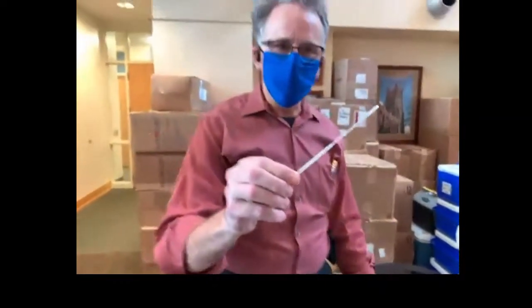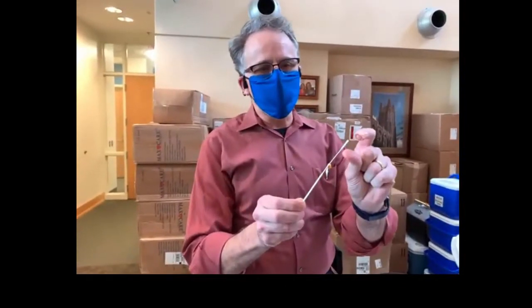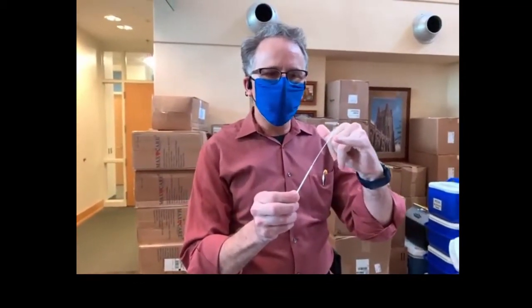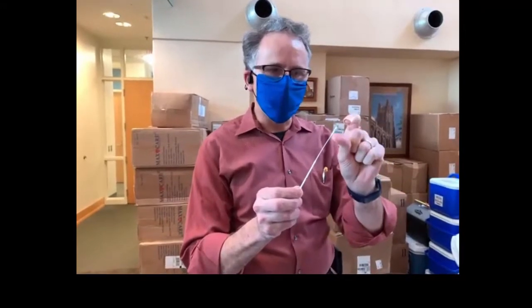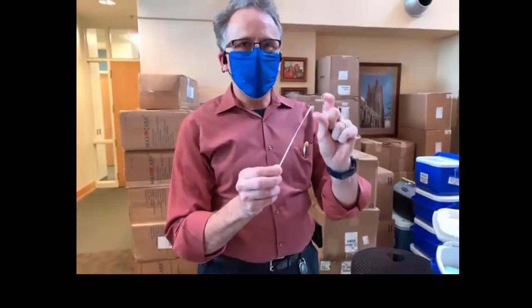This is what the swab looks like. There are several things I want you to notice. First is this end — this is the swab end that's actually going to go in the nose, and you can see how long it is. When the students swab their nose, we want the entire end of that swab, that fuzzy part of the swab, to be in their nose before they turn it around. It's very important that it gets in there.